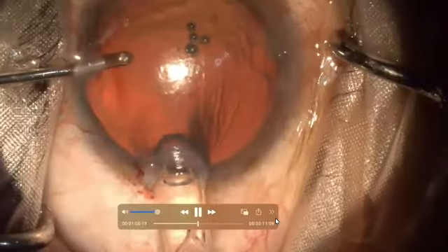This is the IPCL by Care Group. They have a special cartridge for the placement, which is used for injection of the intraocular lenses. Place it properly inside the cartridge. Make sure that the optic and haptic do not catch inside the flanges of the cartridge. Place it properly and move it a little bit inside the cartridge. Make sure that it moves properly inside the cartridge. Once you are sure that it moves properly, place it into the injector system.